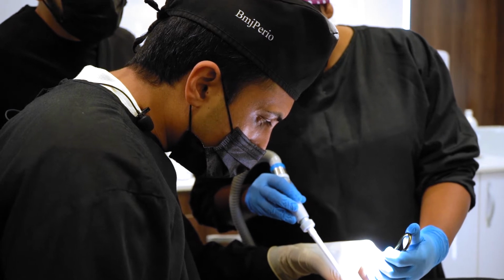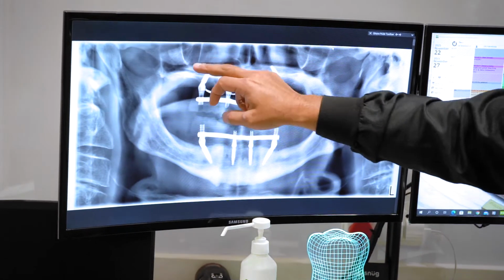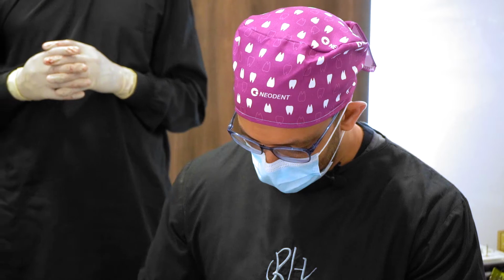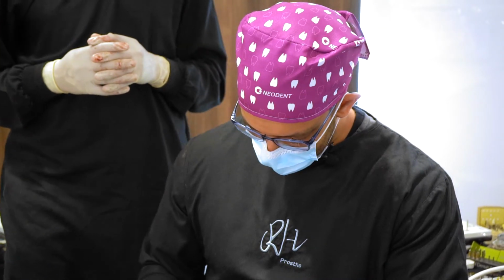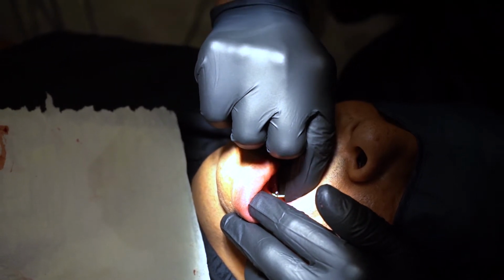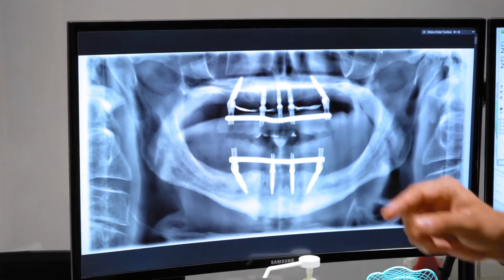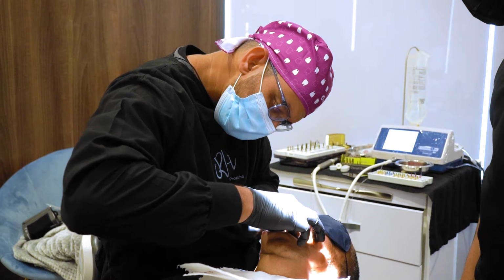Similarly, in the maxilla, when there's alveolar bone loss that occurs, we have the maxillary sinuses that become quite enlarged as well. And the same as the mandible, the amount of space below the sinus and the crest of the ridge is not enough for a standard length implant. So surgeons will place implants at angles to skip the sinus, because there's obviously no sinus in the front of the face that affects implant placement. And that's how we go with a full arch reconstruction in this type of situation.